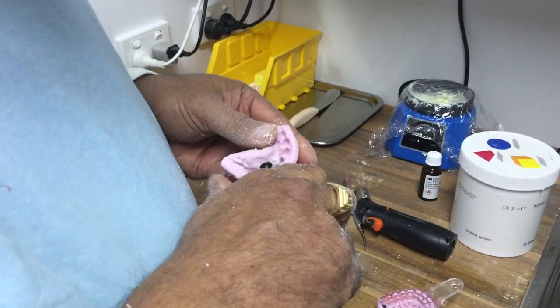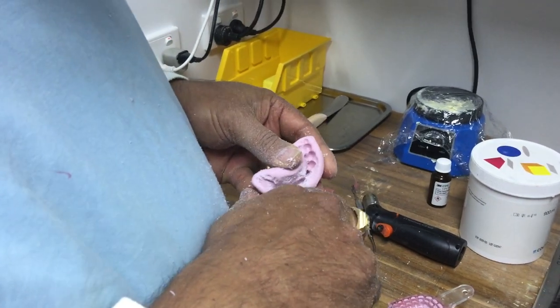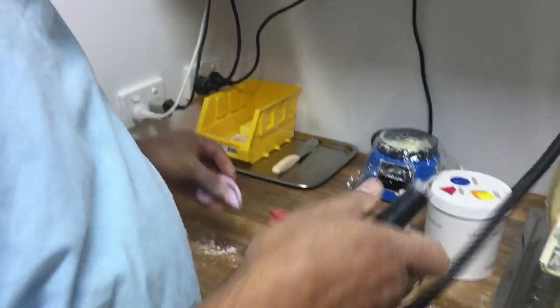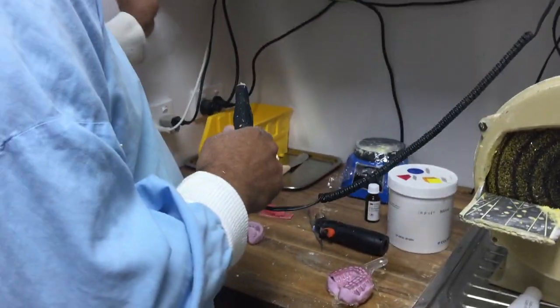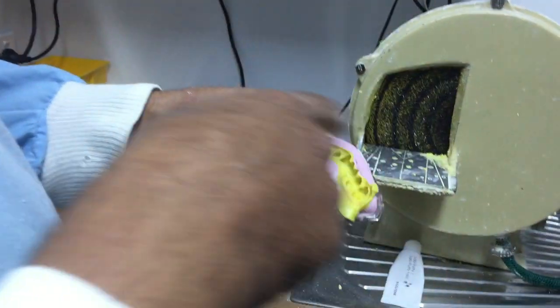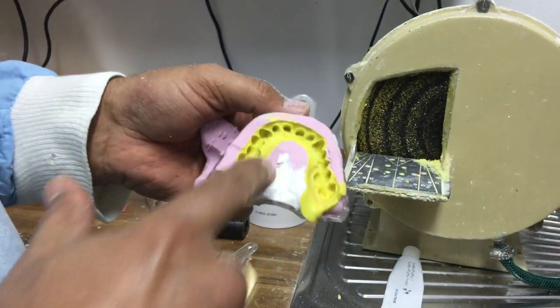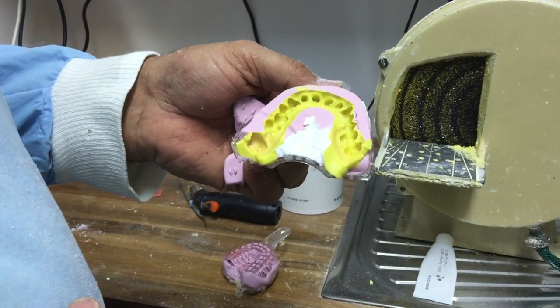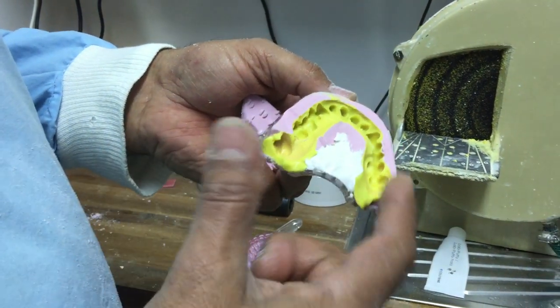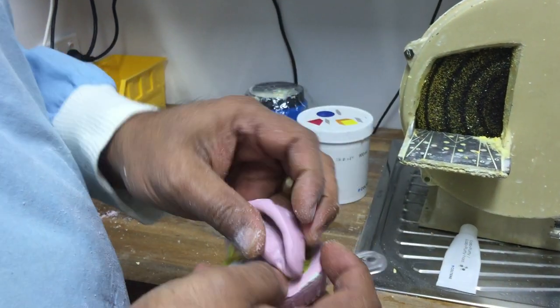The wash material is going to engage those little voids and not delaminate. When I take the tray to the patient's mouth, I load it with the material — as you can see on this impression I've already done — and it turns out really beautiful.